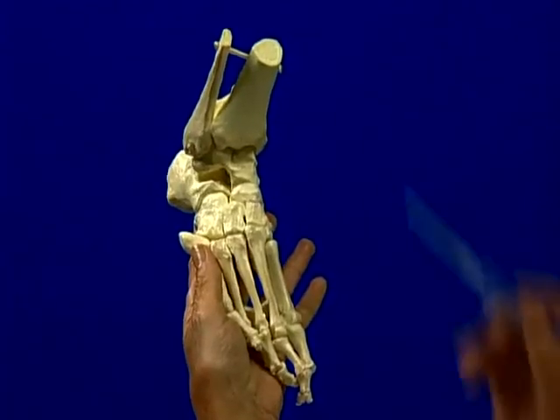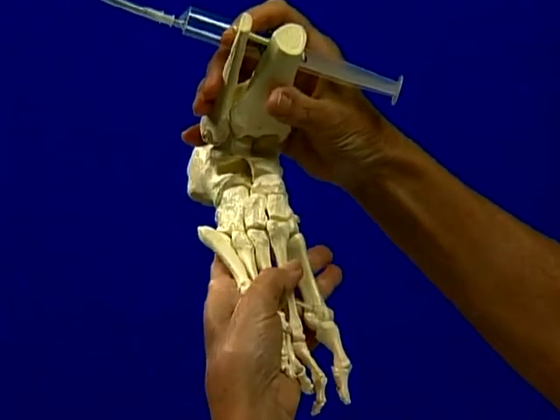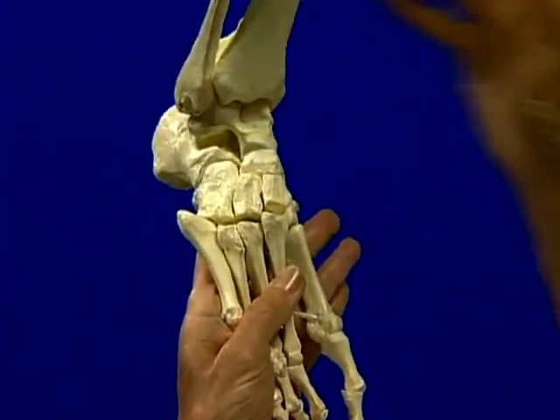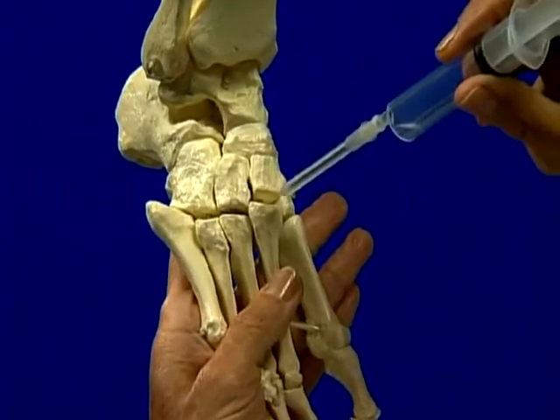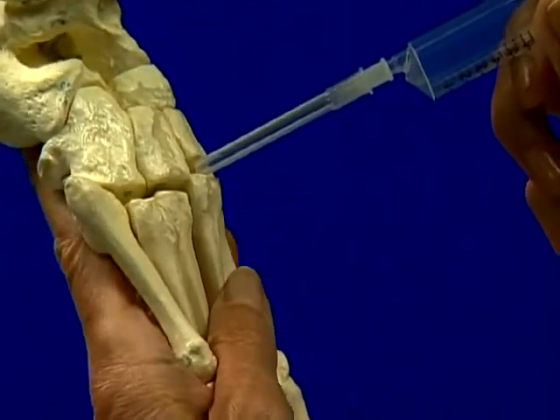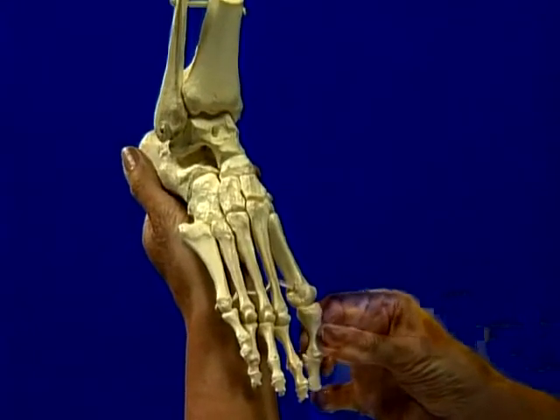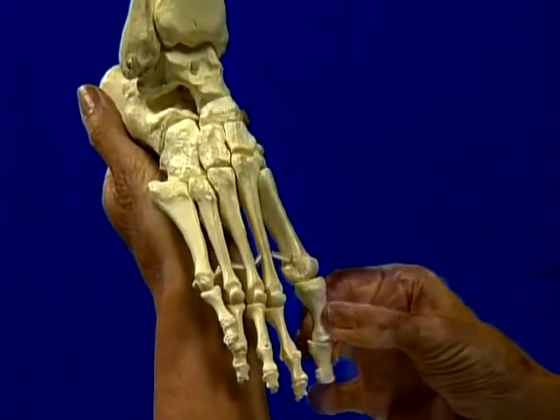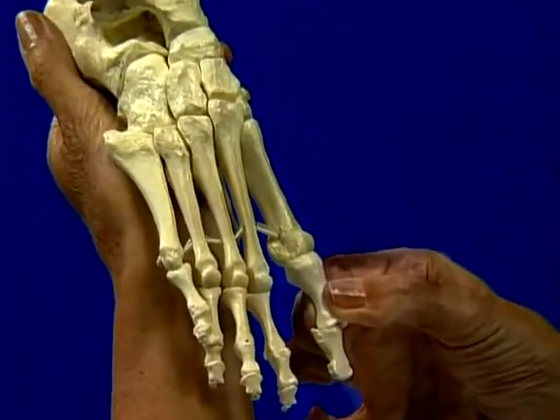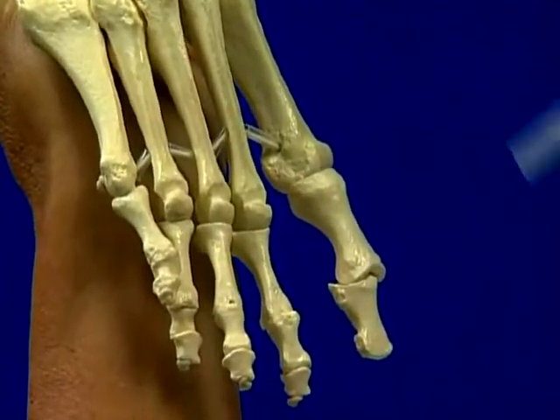Palpate the joint line by opening and closing the joint. The needle is inserted perpendicularly down into the joint space. The joint line is identified by opening and closing the joint. Traction is then applied and the needle inserted into the joint space, avoiding the extensor hallucis tendon.